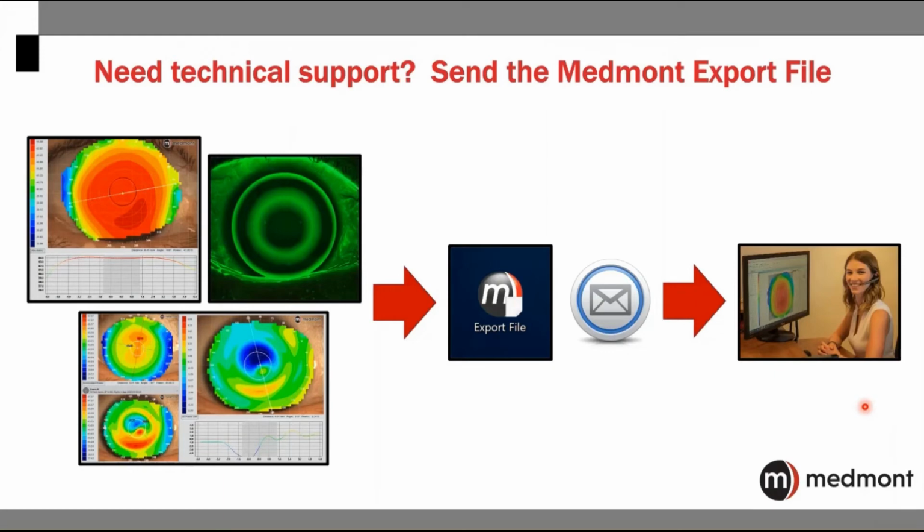Now, if any of this seems complicated, what do I do prior to ortho-K when I'm assessing that baseline topography? How do I build the initial lens? After I fit the lens, how do I assess the post-treatment outcome? What if you're a neophyte to ortho-K? What if you're relatively new to corneal topography and the Medmont? Well, the story is it's quite simple for you to share your information with the lab.